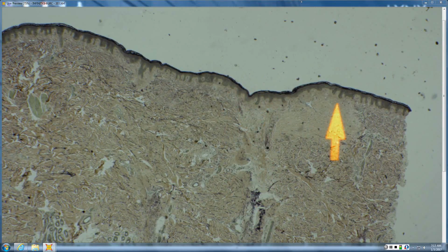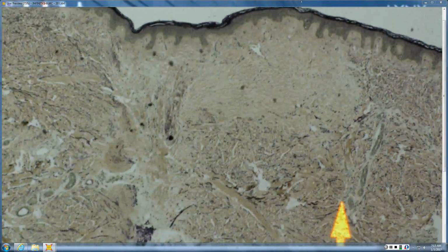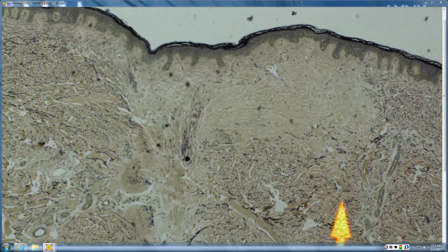And so you can see pretty well here this wedge-shaped area of scar where there is no more elastic staining. And around it, there's some clumping and retraction of that elastin, and that just helps to confirm that it's Lichen planopilaris. Maybe you would do the stain because there isn't a ton of inflammation left. Maybe it's more on its way to being burned out, but then you do the VVG and you can see that the elastic pattern is gone, and that's where all that inflammation and scarring occurred, which points more towards lichen planopilaris versus lupus or CCA or something else.